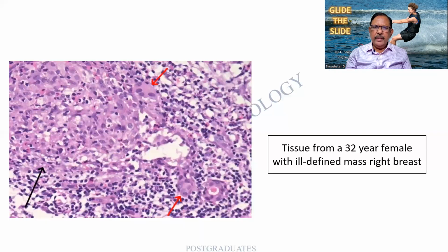The series that I have taken up shall be a slide with a history. In fact, there are some arrows pointing to the lesion whatsoever. But what is expected of us is to know the contents rather than to possess it.